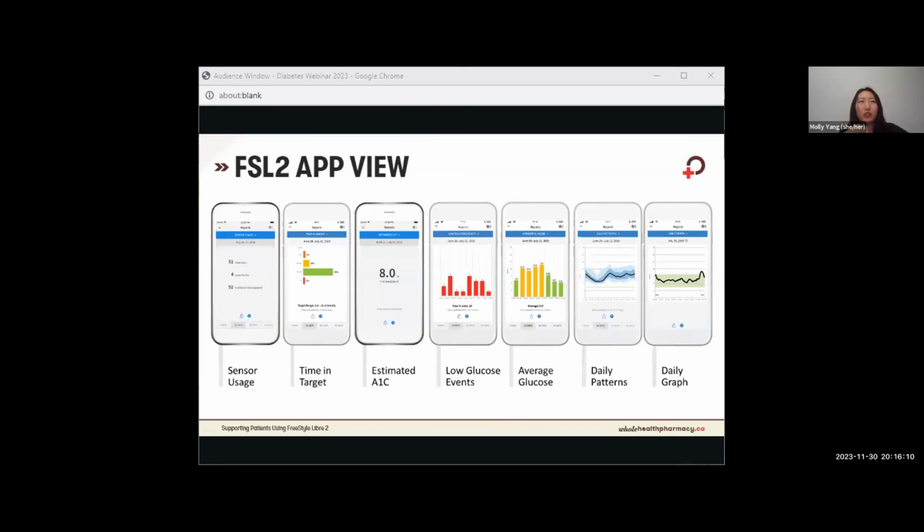And I think it's really important to show patients just how unobtrusive it can be and how easy it is to get all of this data that they didn't get before, to make better decisions with their diabetes management. So if I was that pharmacist, Molly, what I would suggest is, you know which of your patients are using the Libre 2. So I would pick a couple of your friendly patients and say, hey, I want to learn how to use this better to support all my patients. Would you mind letting me see your app? Can you tell me how you use it and what information you're finding useful? And then have a conversation with them about that privately. Maybe they would share their data with you as well, so you can work through it.